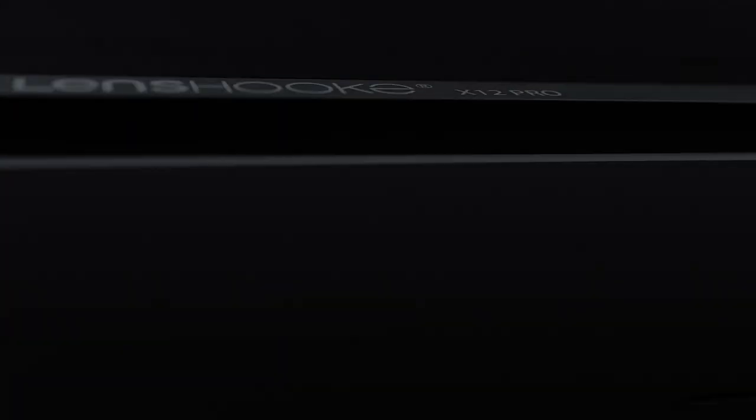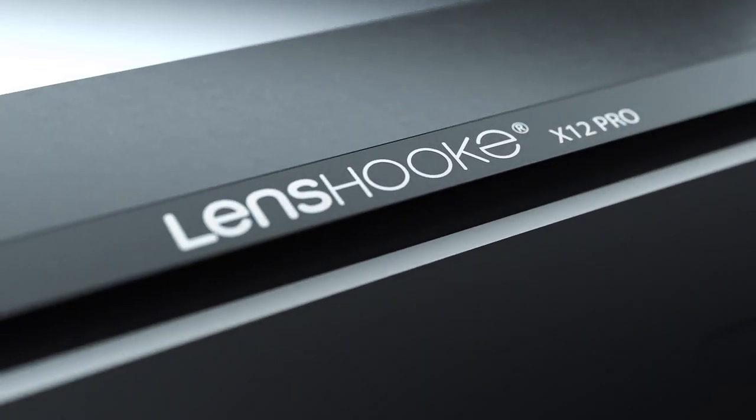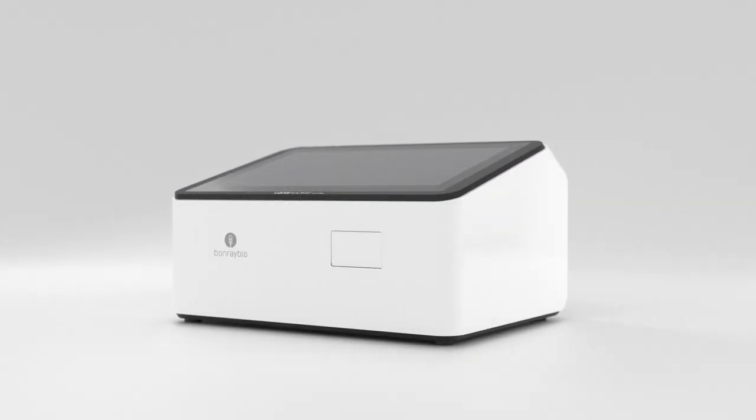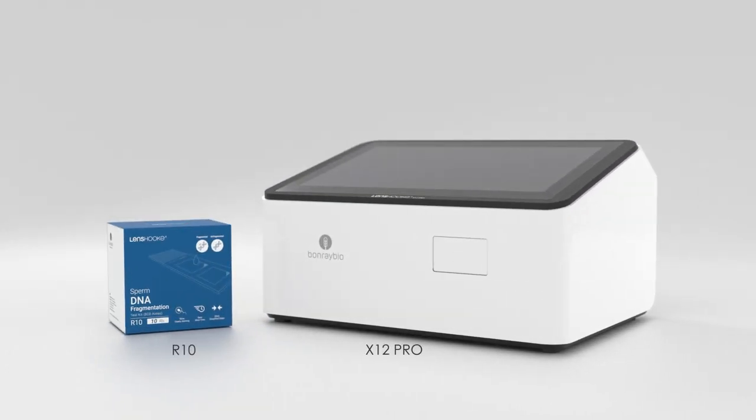Lenshook, the professional of semen analysis, will provide you with a totally new experience of examination. It not only offers you the fully automatic exam system, but also the new formula reagent.